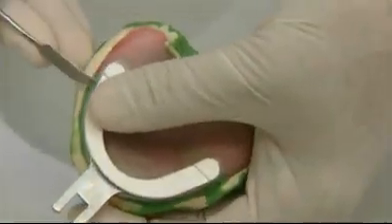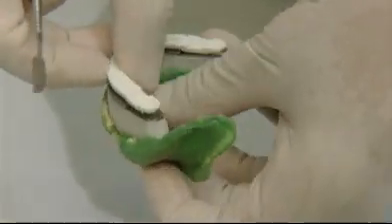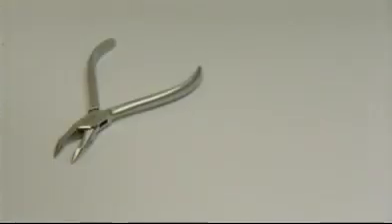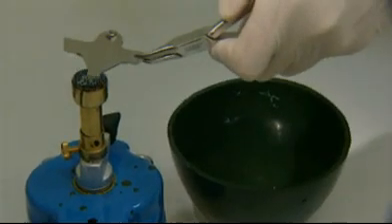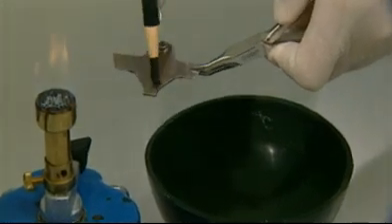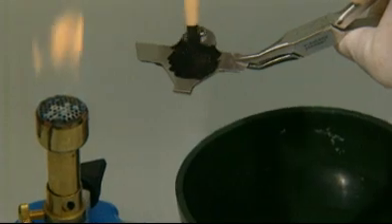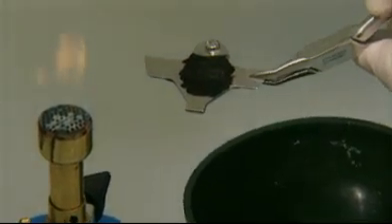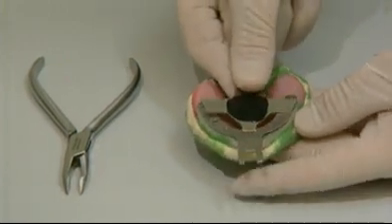Then, remove the bite rims and replace them with the registration plates. Insert the plates by means of pointed pliers to avoid damaging the impression margins. To carry out the needlepoint tracing procedure, remove the maxillary impression from the oral cavity, remove the registration plate, and coat it with a thin layer of wax paint. And insert it again.